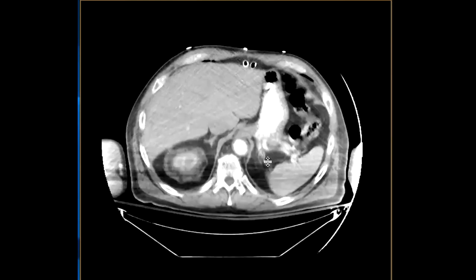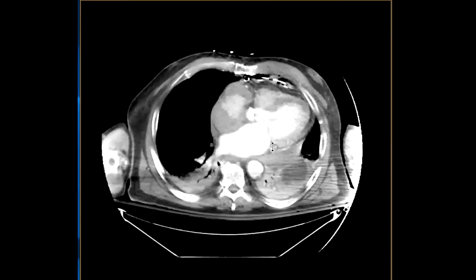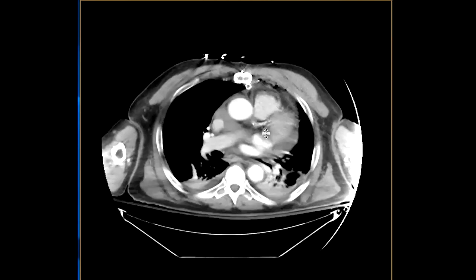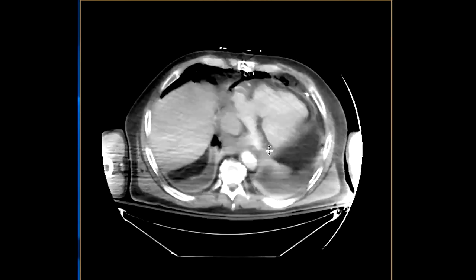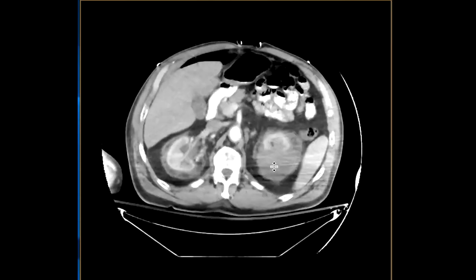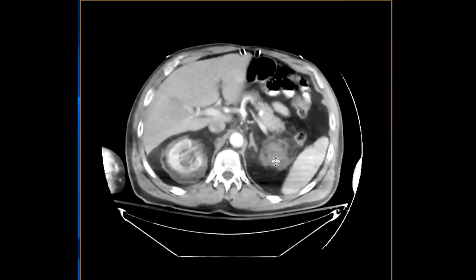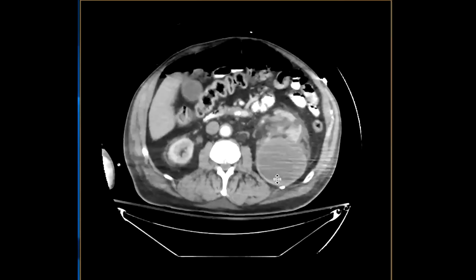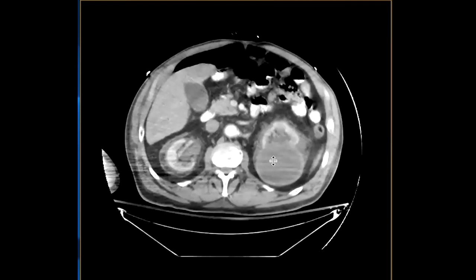This turned out to be an exceedingly rare case of Erdheim-Chester disease where the patient also had cardiac involvement, with soft tissue surrounding the right atrium and some of the valves. This was an unfortunate case with quite pronounced systemic involvement. Of course, you can't make this diagnosis prospectively — you can suggest it in your differential, but one would need to biopsy it to confirm, and this indeed was a case of Erdheim-Chester disease.